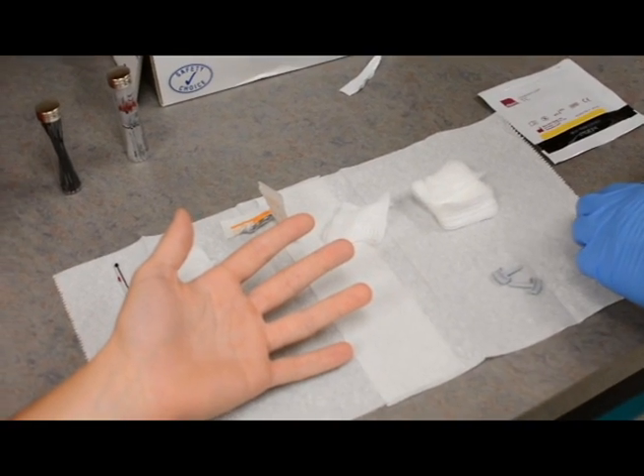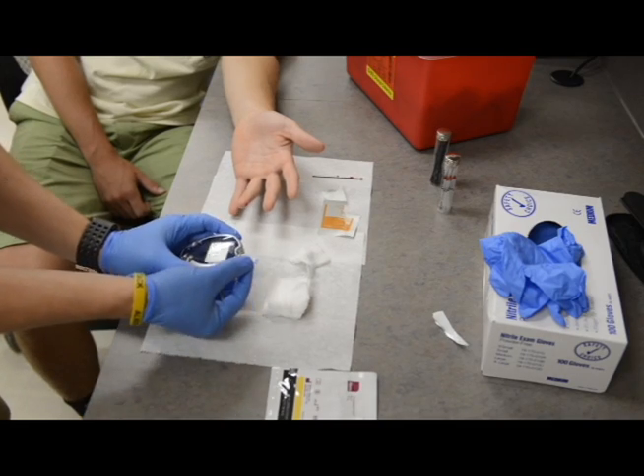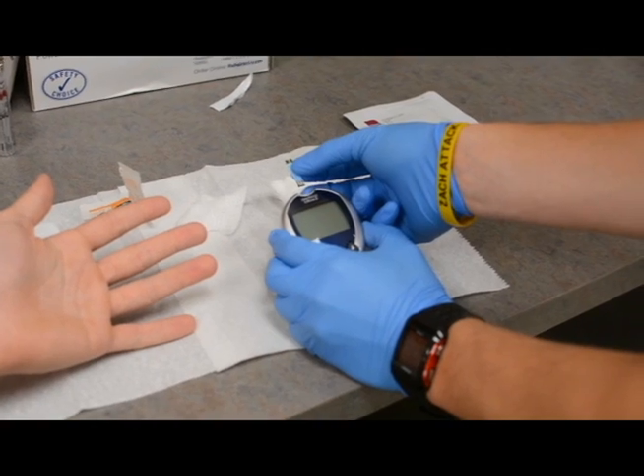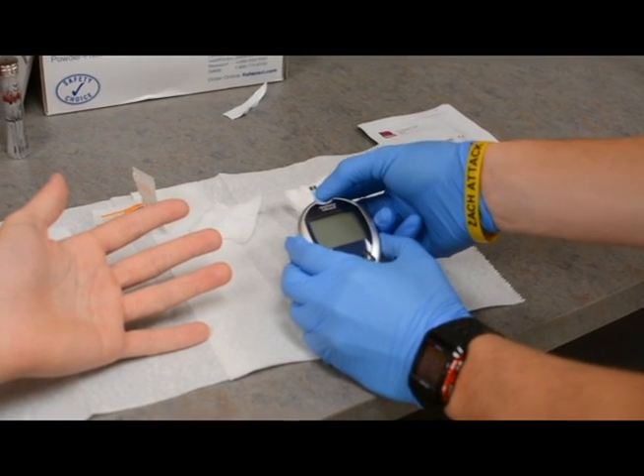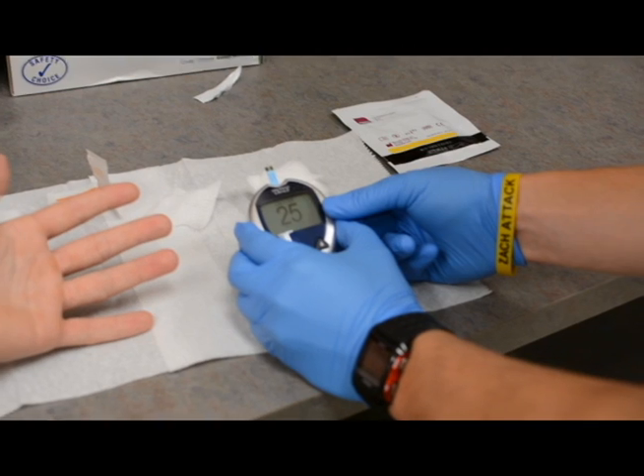Once you've done your finger stick, what we're going to show you next is how to gather that sample for appropriate measures. What we're doing here is going to be a blood glucose measurement. So again, you take your glucometer and you place your test strip in.